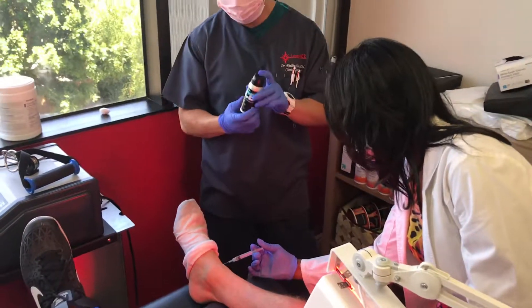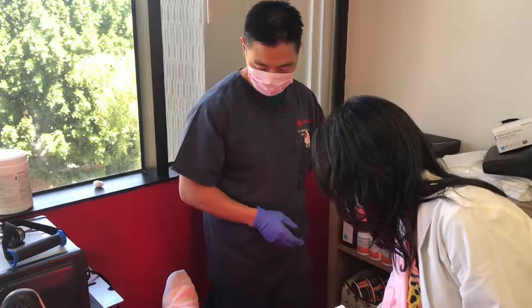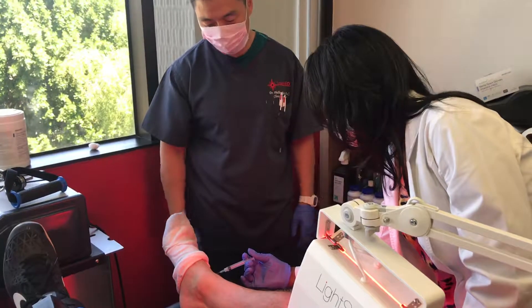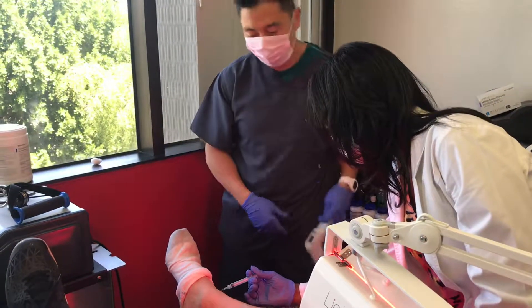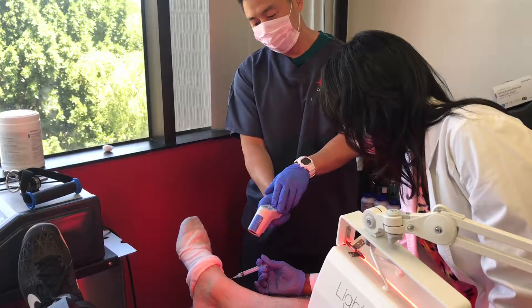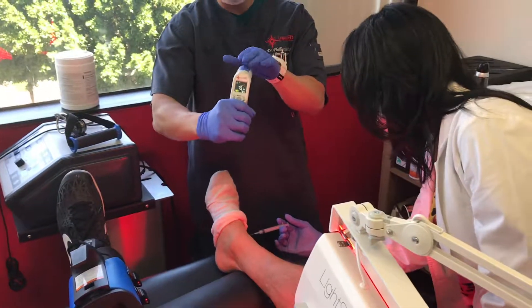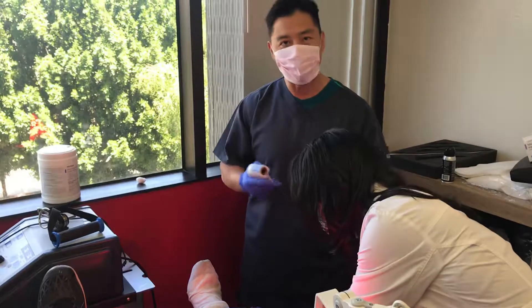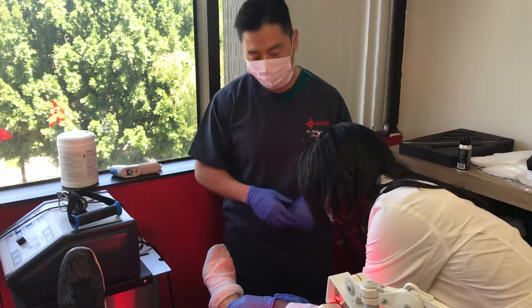I had sprayed some cryo ice to numb the area to make it more comfortable for the patient. You can see those cells are going in really smoothly because it's laser-guided with the infrared thermometer, and that was the point that showed the area of greatest inflammation. That's where the stem cells are going to go, because they are activated and they will go to the target tissue that has the most damage and inflammation.